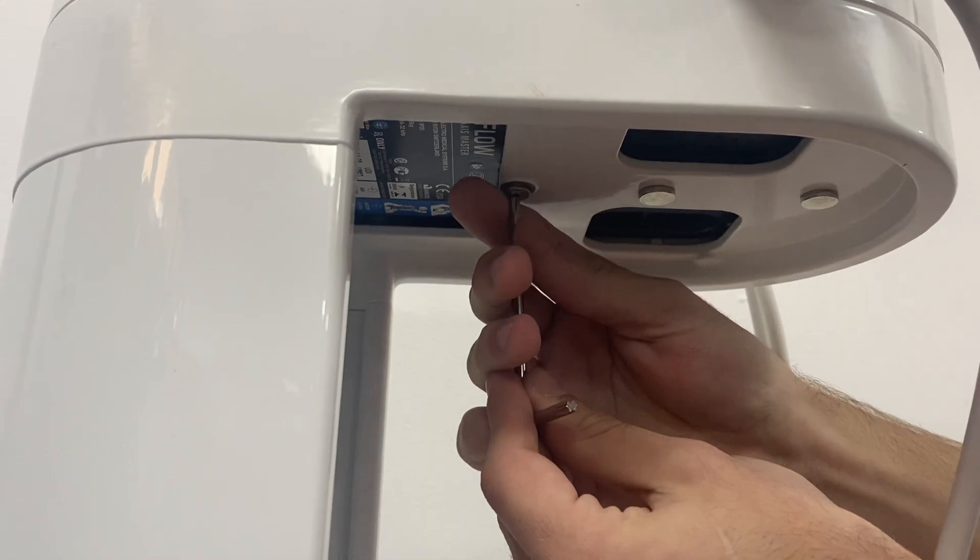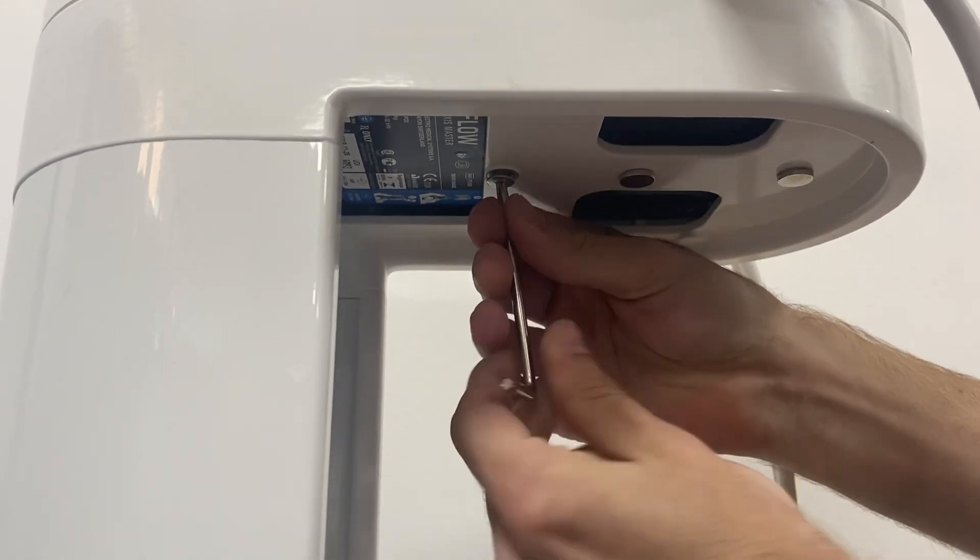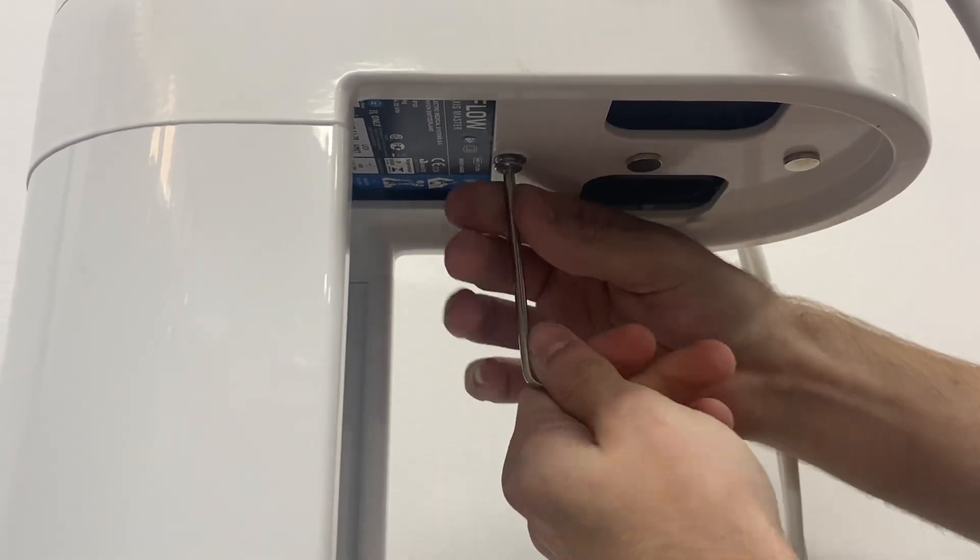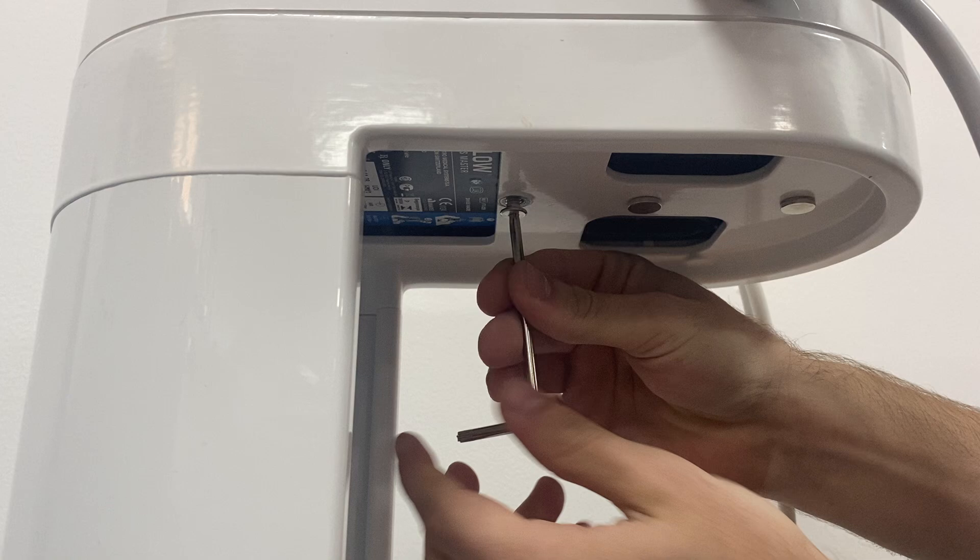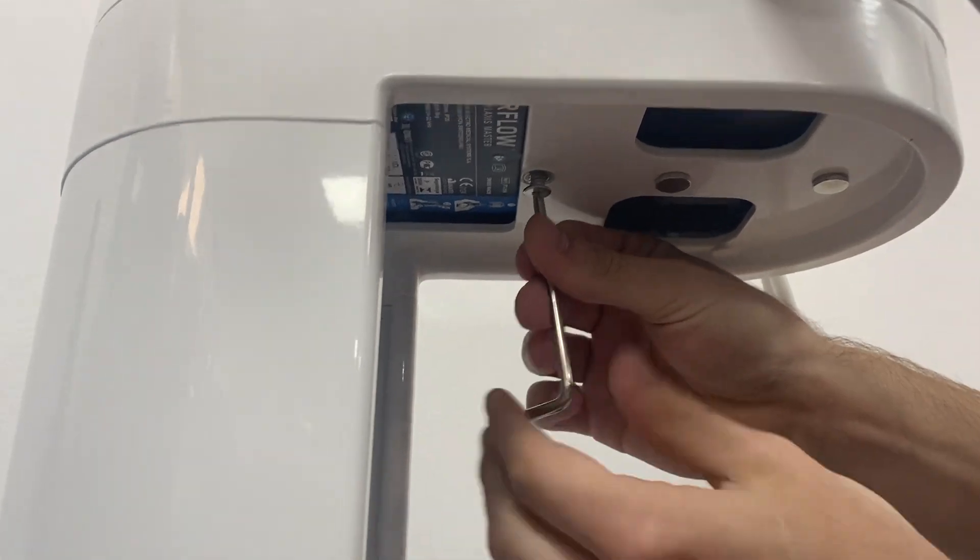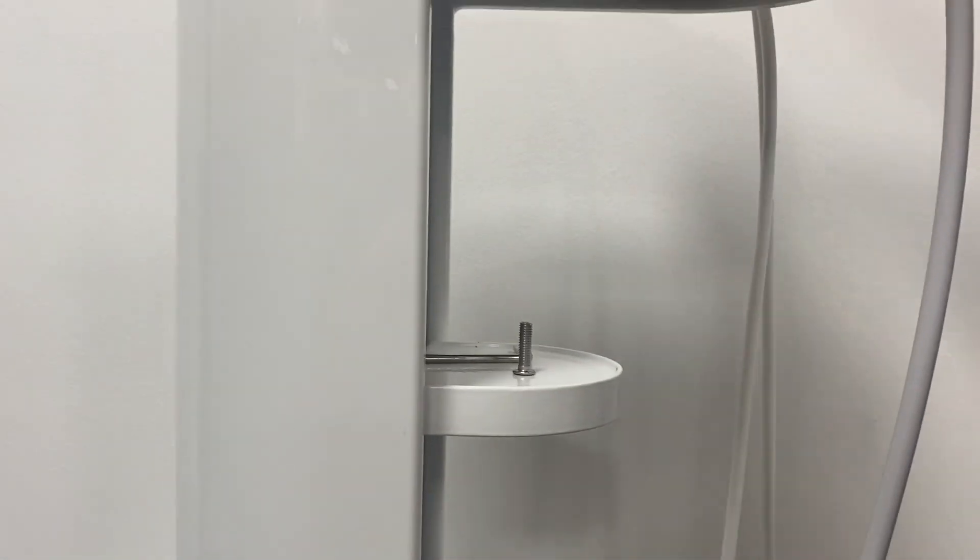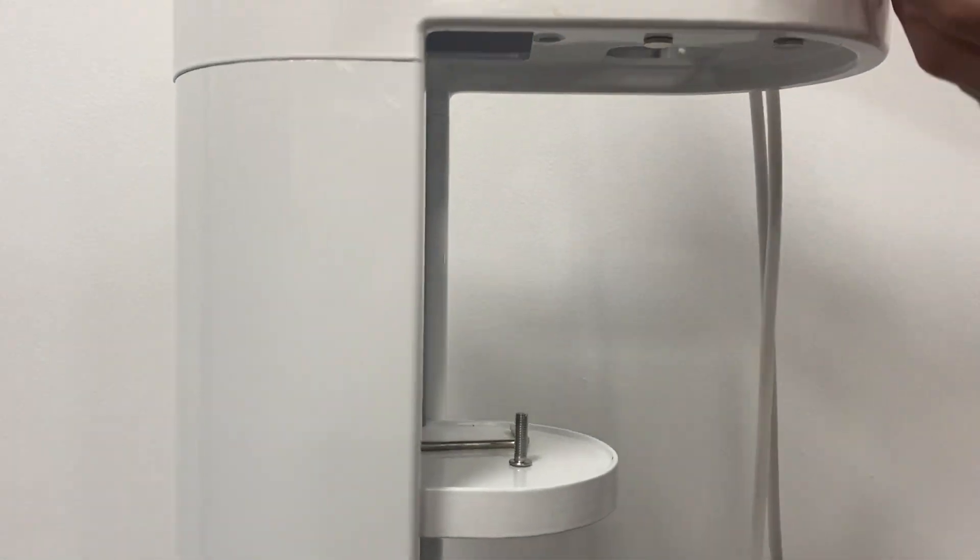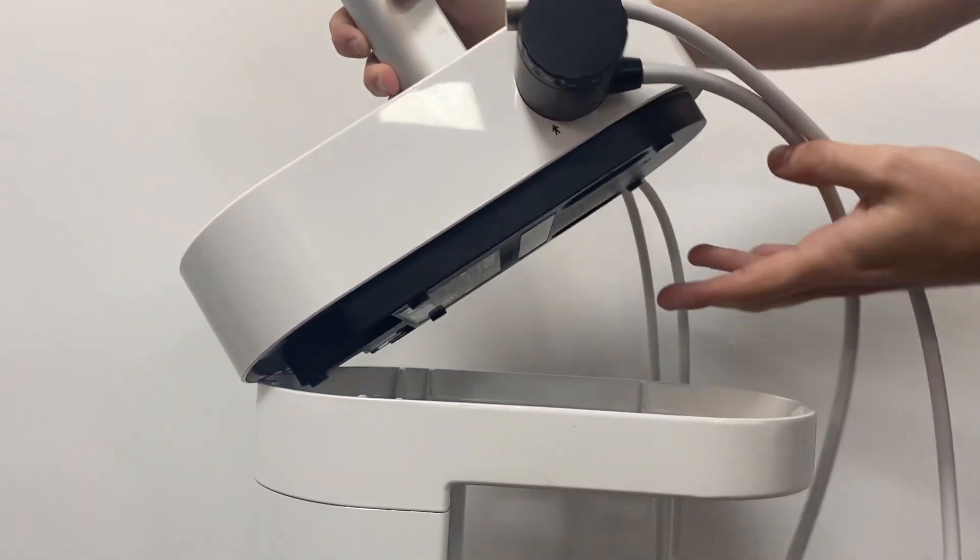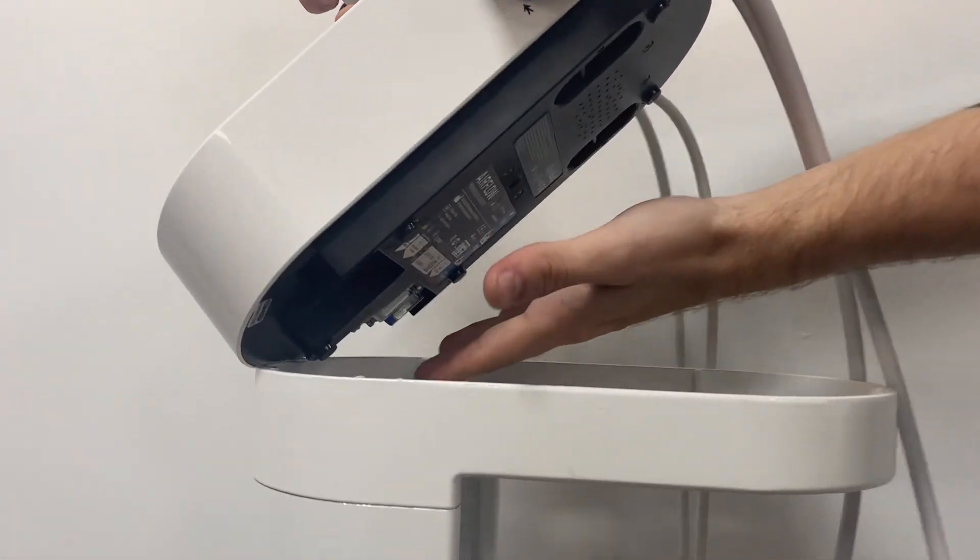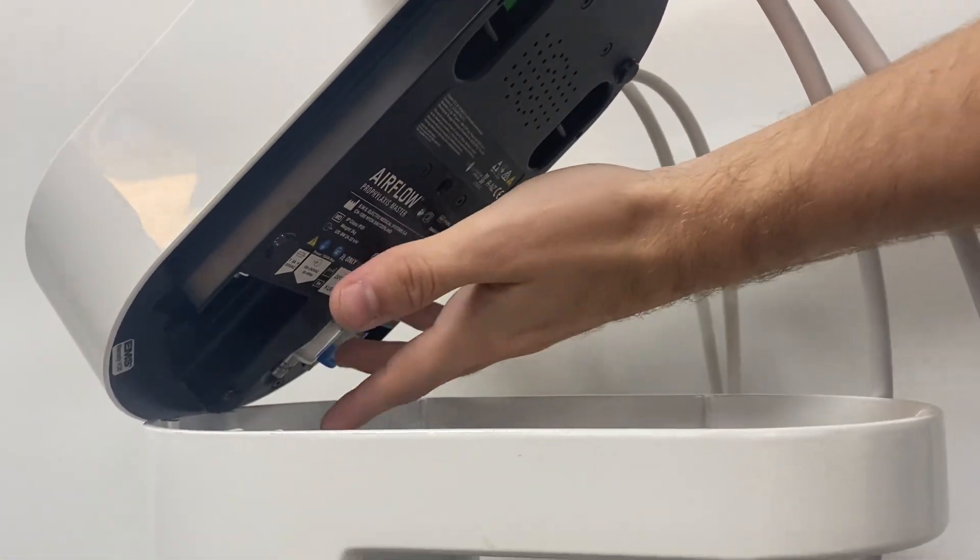Then loosen the screw like this. Once that's loosened, just pull down and then you'll be able to remove your prophylaxis master. Your air and water lines and power cord will still be attached at the back.